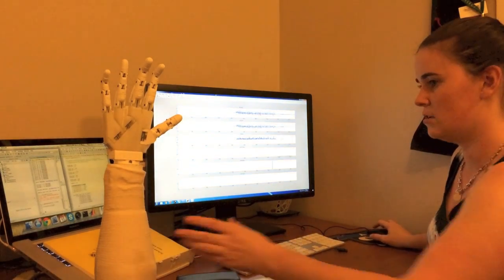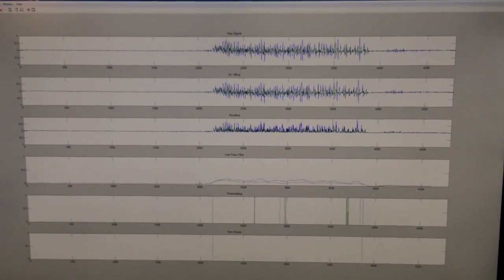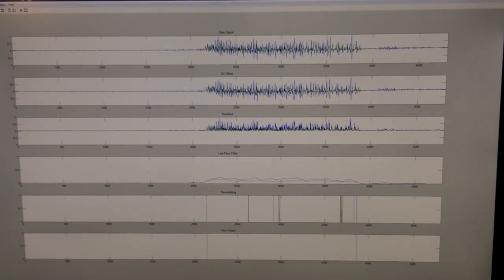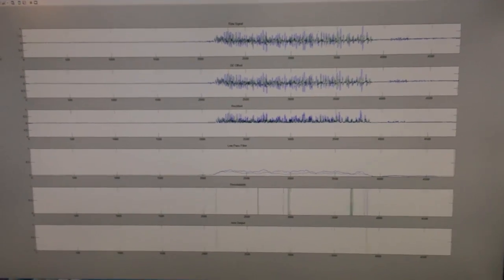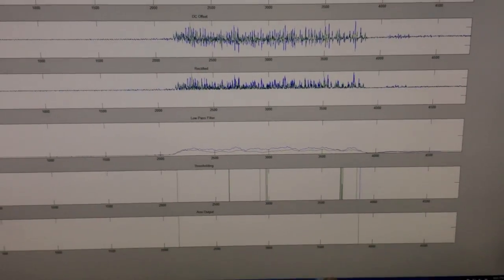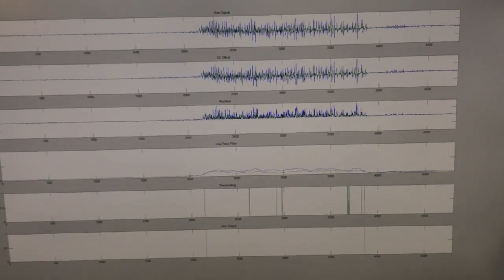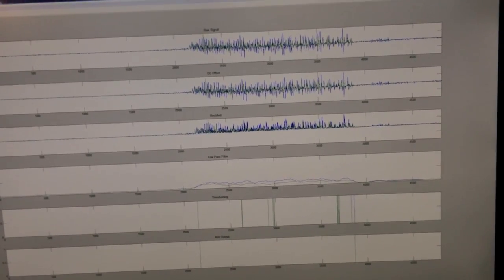And what's been produced here on the screen, that top signal there is the raw data. So that's basically the same as what I was getting on the other piece of software we looked at. And as you can see, there's various steps which I go through to get to this bottom step down here. And this step here, you can see it's a nice square wave. And that's what we put into the servo motors. So that's just a really clean when it's on and when it's off. And you can see that the length of that square wave is proportional to the actual length of the activation.